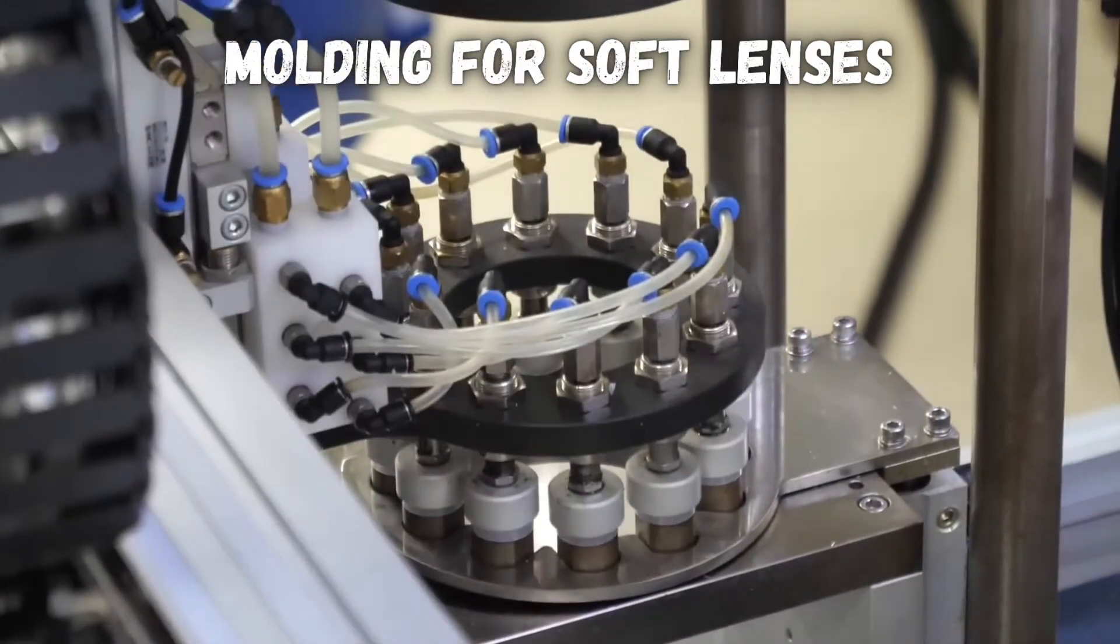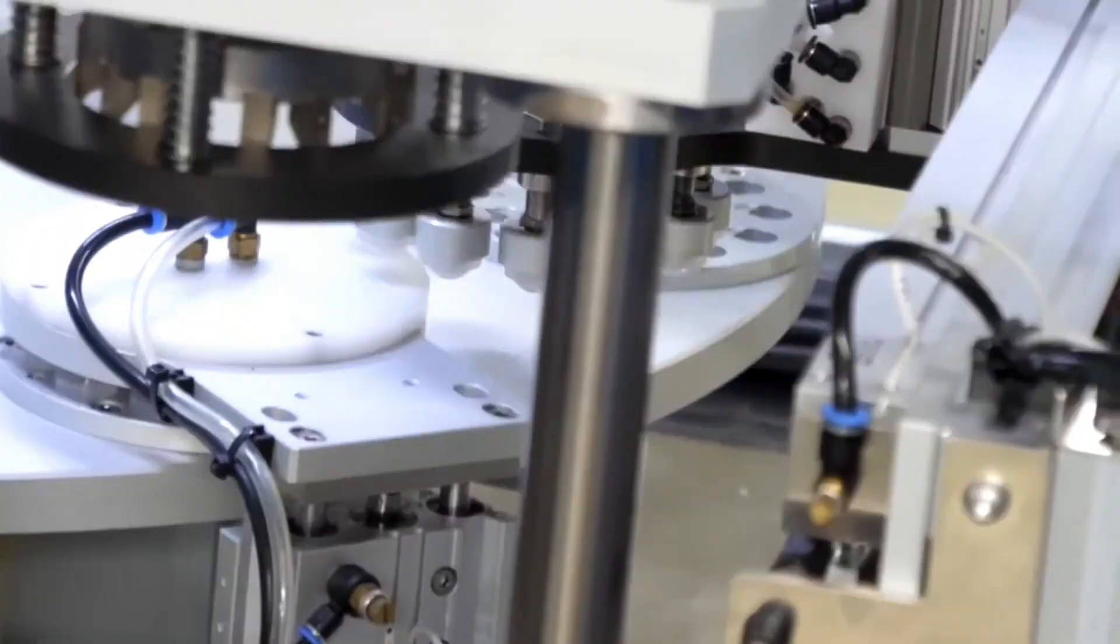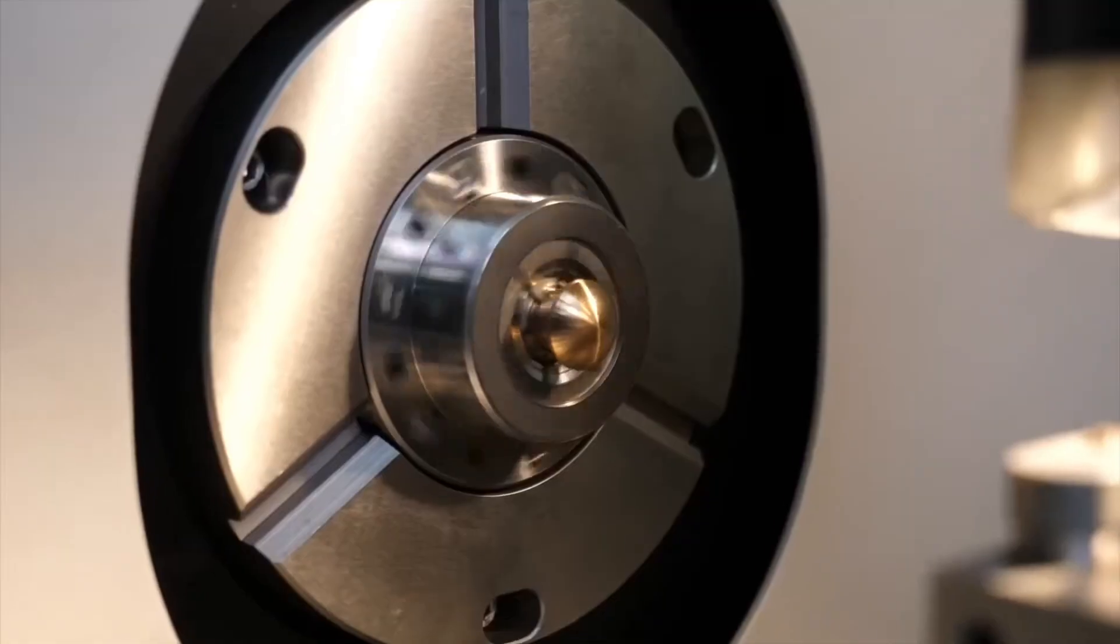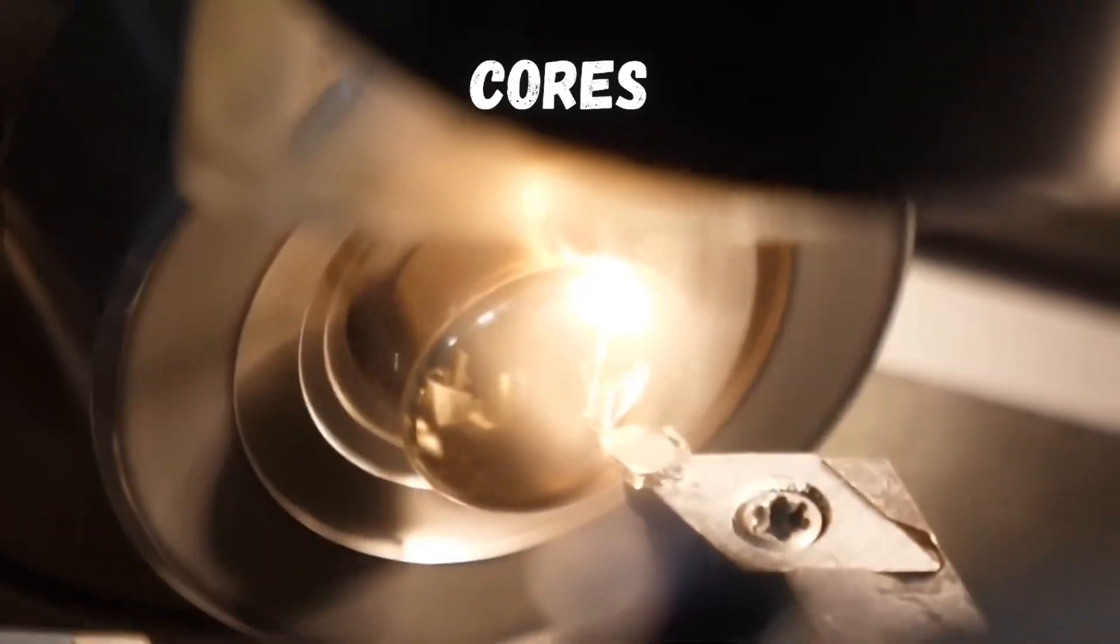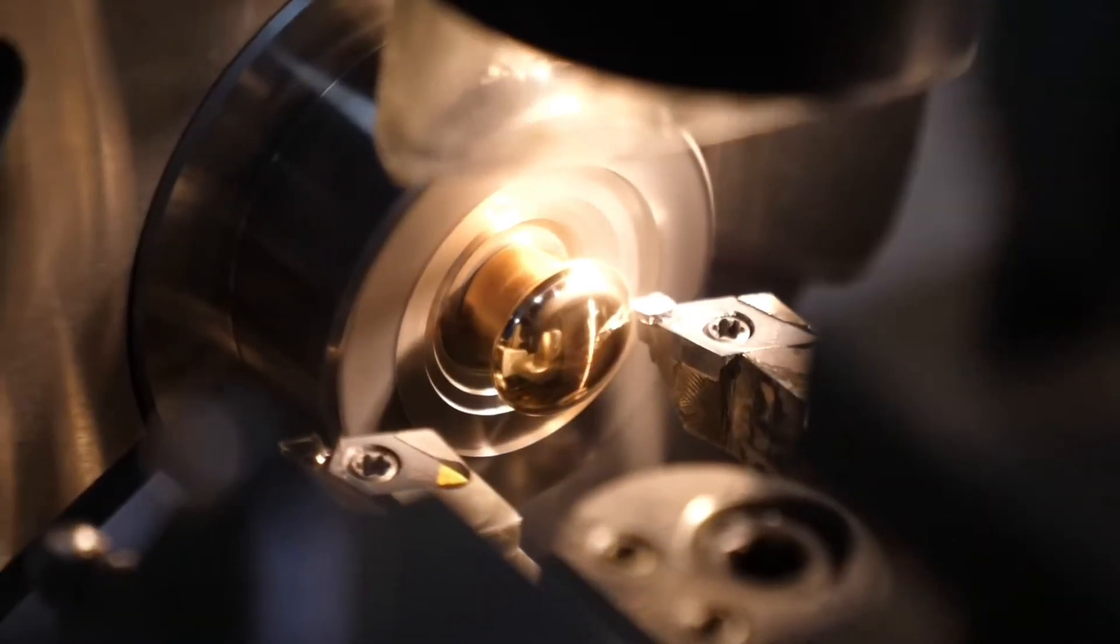Soft contacts are molded into the shape needed to correct for a certain eye prescription. High precision machining creates metal pieces called cores with the specific curvature needed for the contacts.